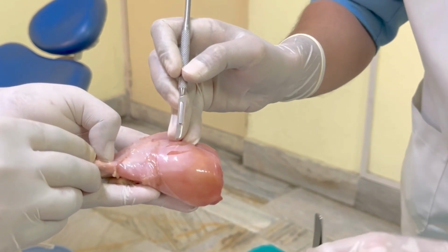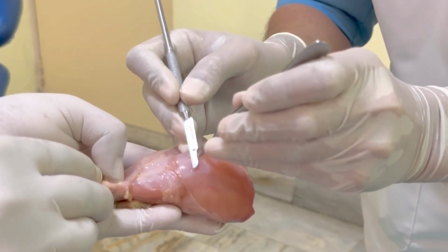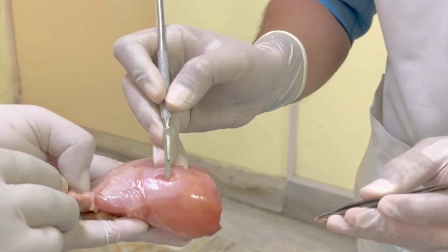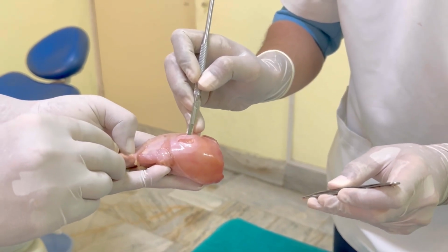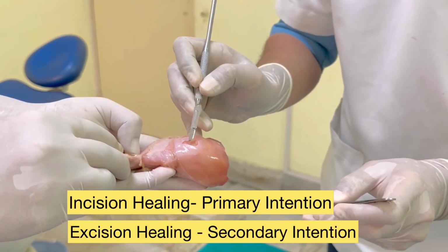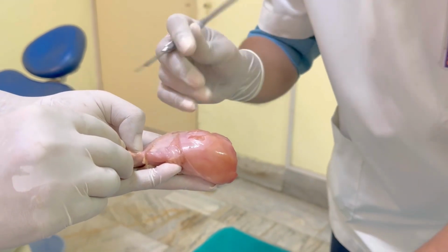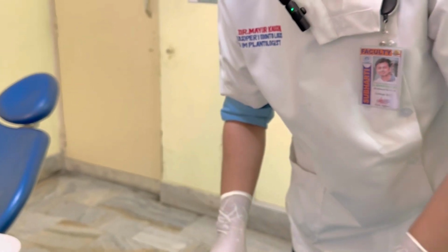On the other hand, if I have to do an excision, I'll be removing it like this. Here the oozing will be even more, because in the case of an incision, I'll be able to approximate using sutures, but in the case of excision, instead of healing by primary intention, the healing will be by secondary intention. That brings us to the next question: where exactly would these things be used?